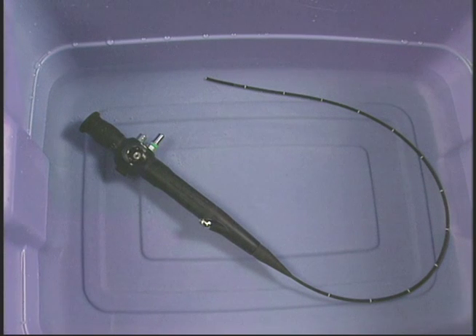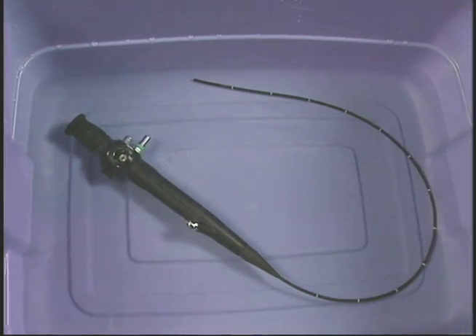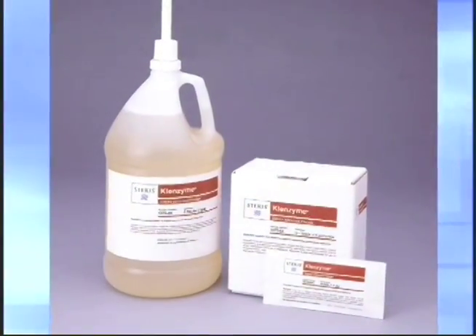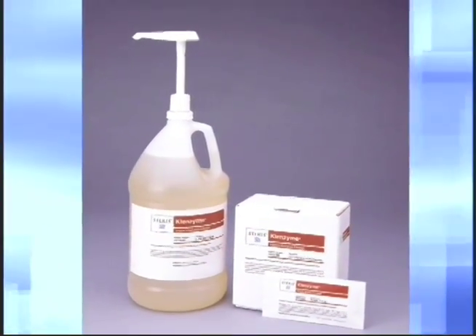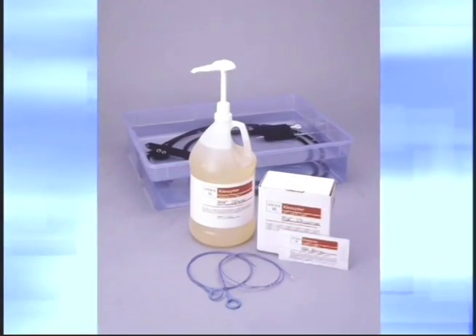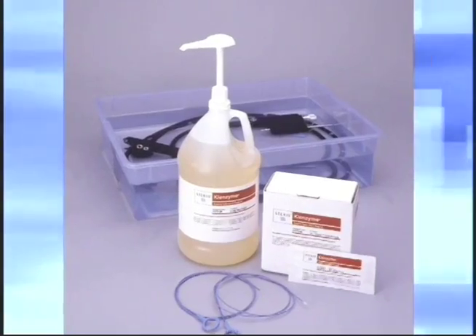Place the endoscope in a plastic container large enough to accommodate the instrument with the shaft loosely coiled. Immediately after use, soak with a neutral pH enzymatic cleaning solution such as Endozyme, Metrizyme, or equivalent, per manufacturer's instructions, to prevent blood, protein, and other contaminants.